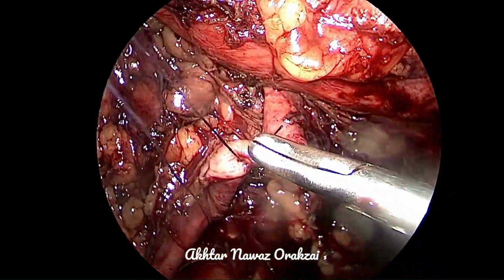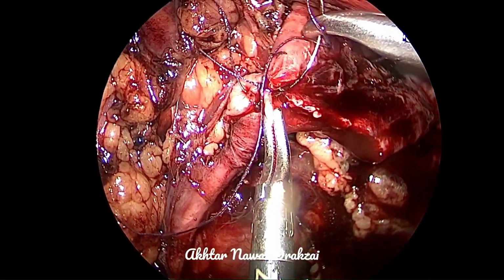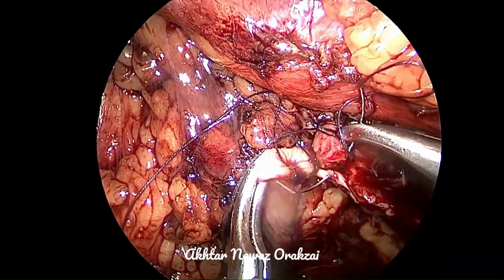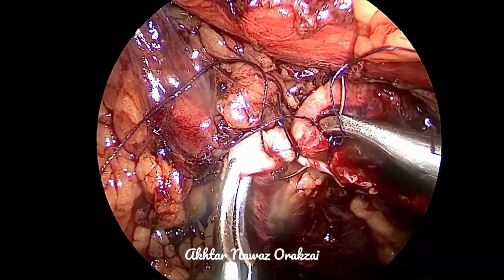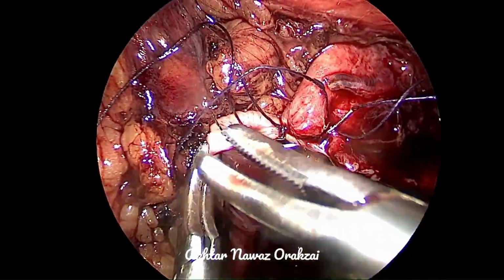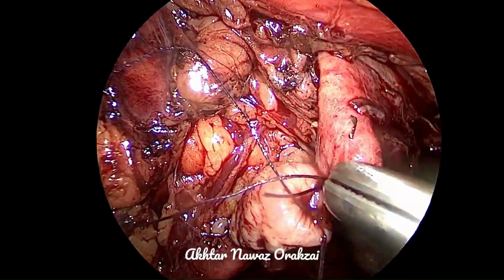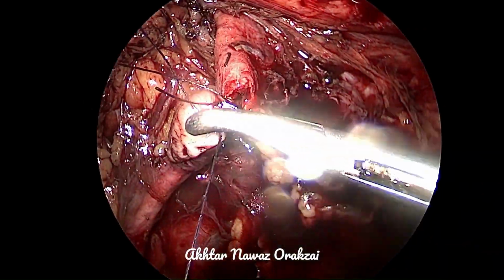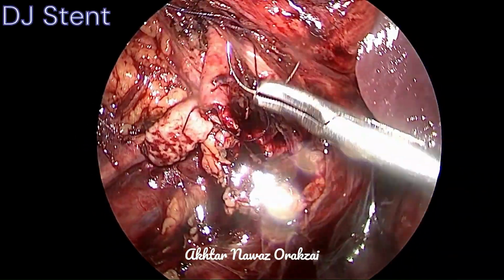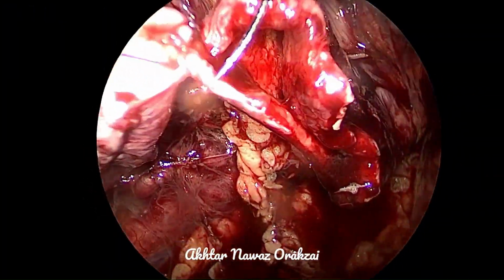It is just personal preference. Whichever you like, whichever you are comfortable with, whichever you are expert in, you should follow that. So I follow continuous anastomosis, even if it is a small pelvis, even if it is a narrow ureter, even if the anastomotic area is very small. I always go for continuous suturing. However, as I said, interrupted suturing is also acceptable if it is watertight.